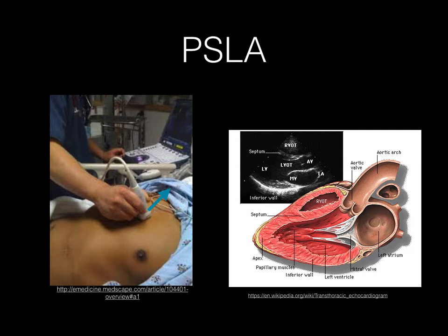For the parasternal long axis view, you will put the cardiac phased array probe with cardiac preset. The probe will be applied parasternally, marker pointing towards the patient's right shoulder. You want to have on your screen the section of the heart where you can identify the mitral valve and the mid portion of the left ventricle.